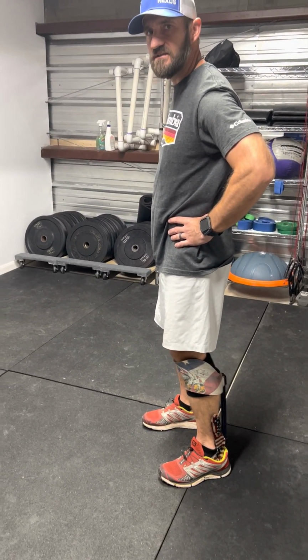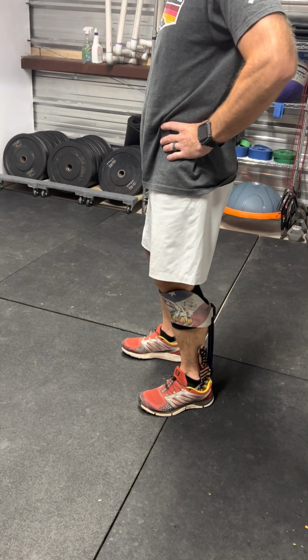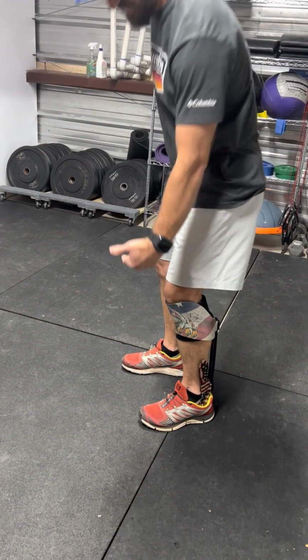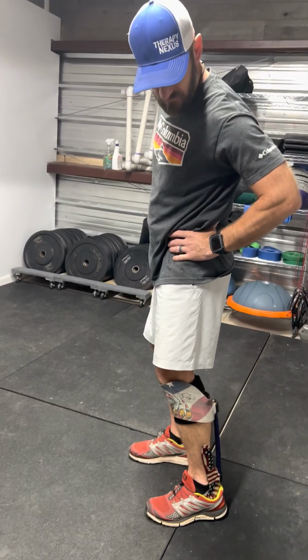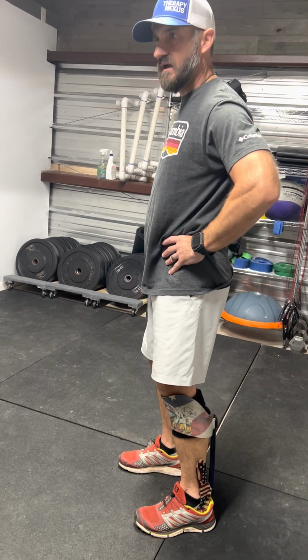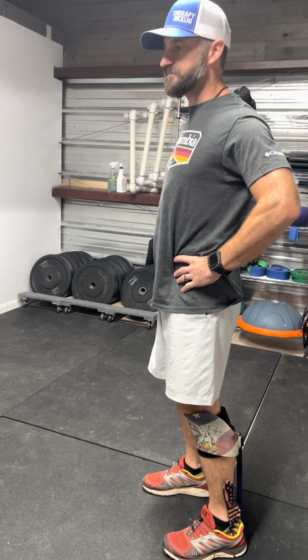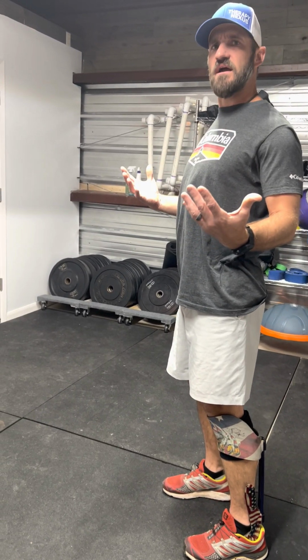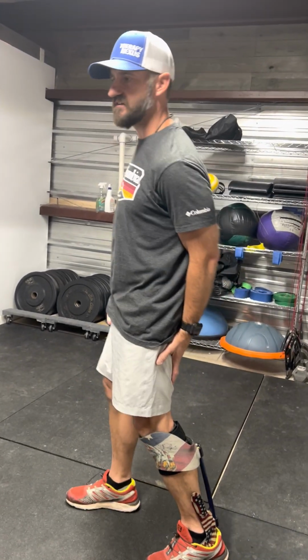If you push that knee in just a little bit, so you watch my knee here, I'm literally just resting on the front of my knee. Like the pressure is right in here. And that's what's doing it. You can see the struts activate just a little bit when I do that. And you can stand in line all day like that when you're waiting at the airport. And stand up good, so have good posture. If you squeeze your glutes, it's even better. That way your posterior chain's activated.